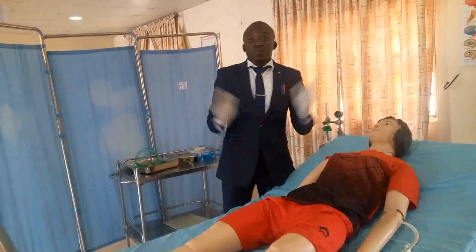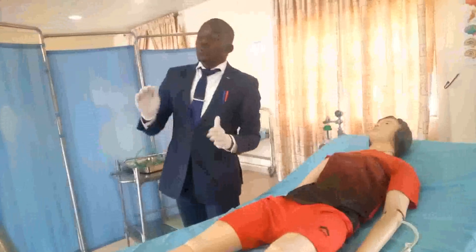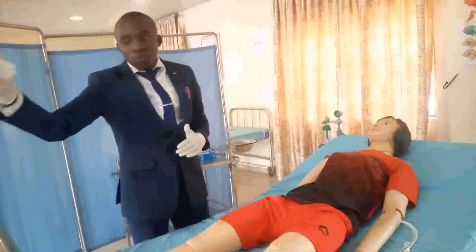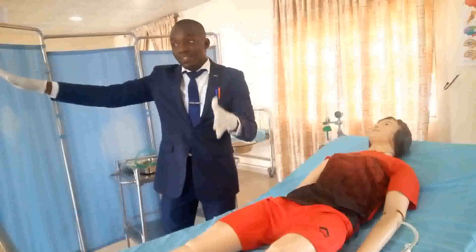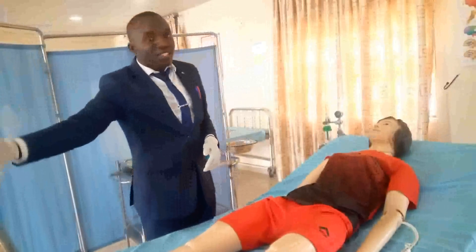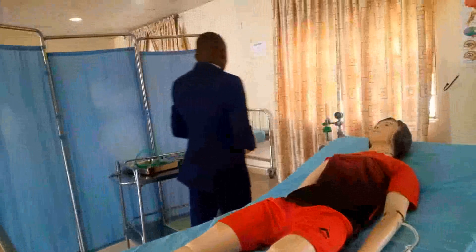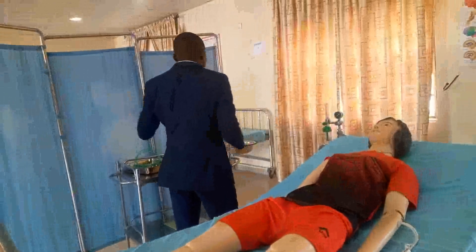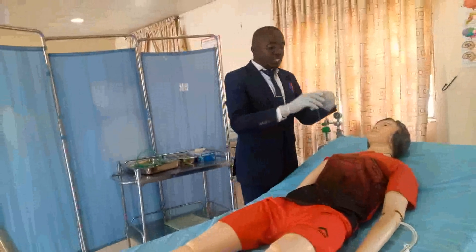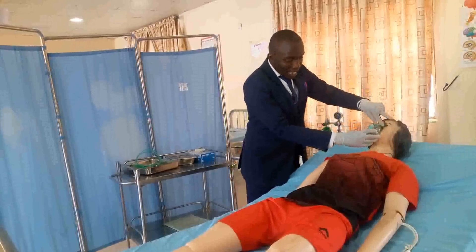Now the procedure. In the procedure, you have to start by placing a 'No Smoking' sign at the patient's bedside. Then take the patient's mask and measure it to confirm it is the correct size for the patient.